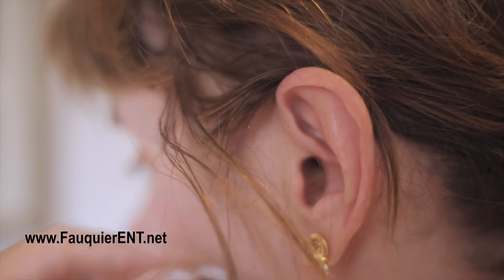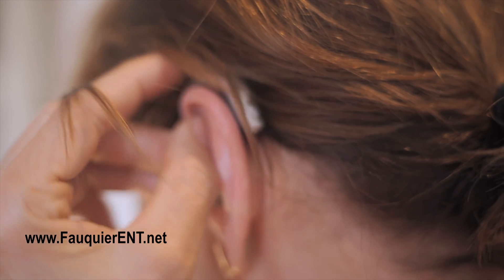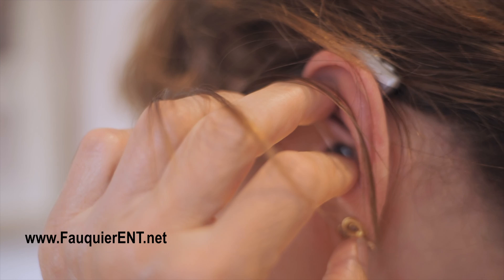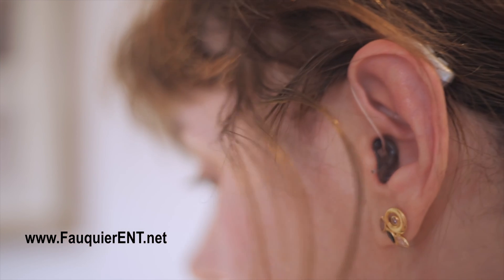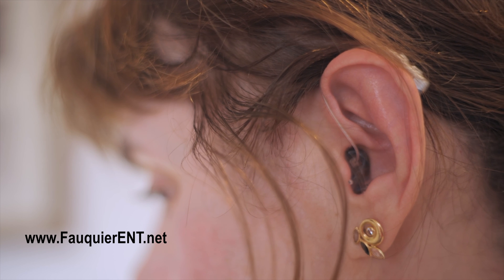In summary, to get the most out of your hearing aid, it is very important to select the best type of rubber dome or even a custom ear mold for your pattern and severity of hearing loss. Incorrect selection can make a hearing aid not work nearly as well, leading to frustration and dissatisfaction with your aided hearing ability.